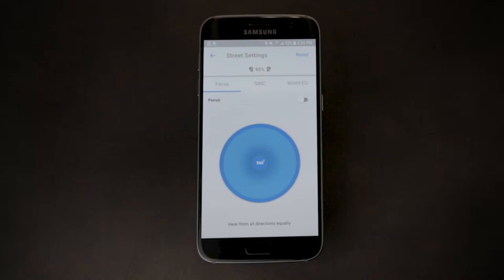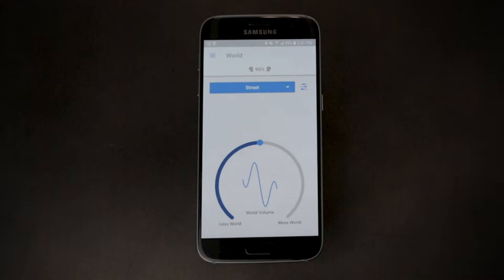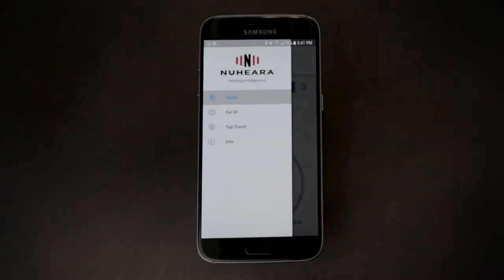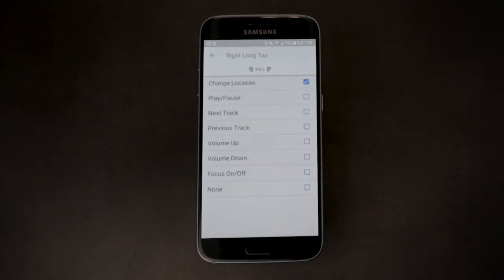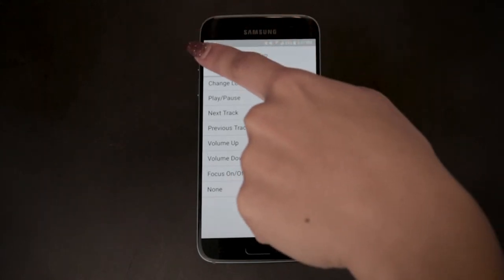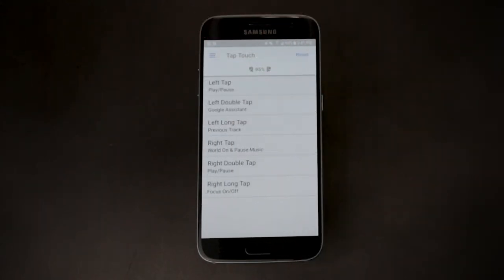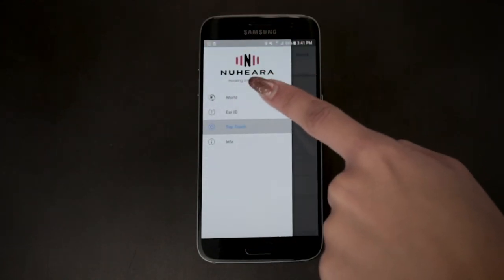First, choose the location you want from the home screen, such as office. If you want to be able to turn Focus on and off by tapping the earbuds, click on the tap touch icon in the menu of the home screen. From there, select right long tap at the bottom. Select Focus on/off at the bottom of the list. Now, without using your phone, you can simply press and hold your right earbud for a couple of seconds to turn Focus on or off in any location.